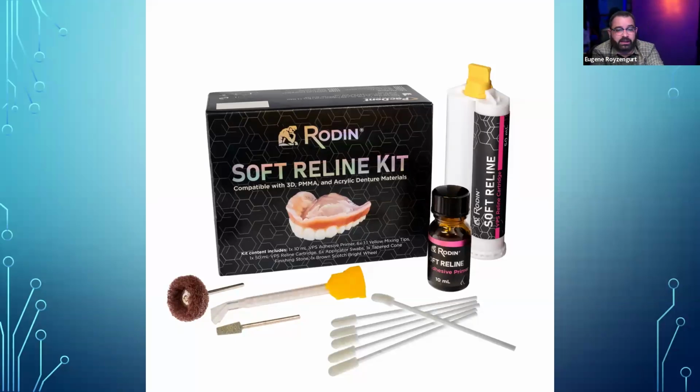So this material here will actually attach really well to printable and to regular PMMA as well. Okay. And I've had some really good results. I mean, guys, I've posted videos on Instagram. I've posted videos on Facebook where I've attached it to a printed resin and I could not rip it off with my hands. Okay. So really, really good bonding protocol. The important thing with this stuff, just follow the instructions, guys. When they tell you to use this little Scotch-Brite wheel to roughen up the surface of the denture, make sure you do that, because if you skip this step, the stuff will not bond.